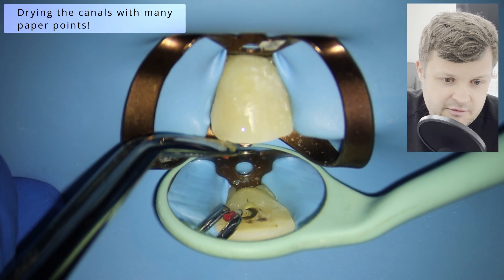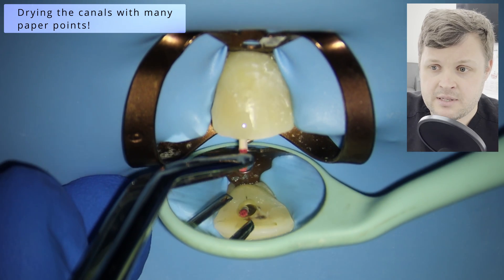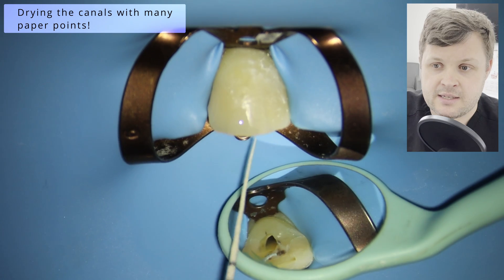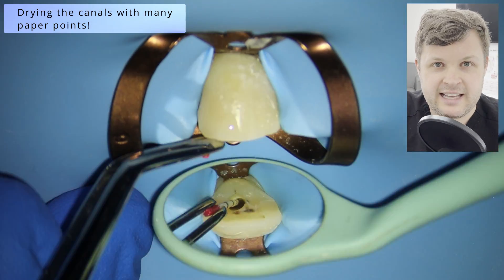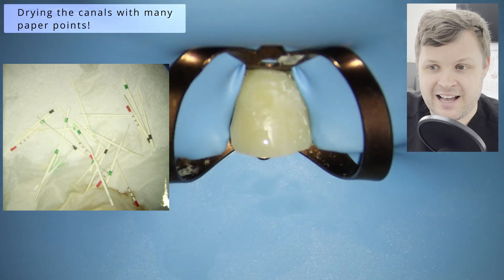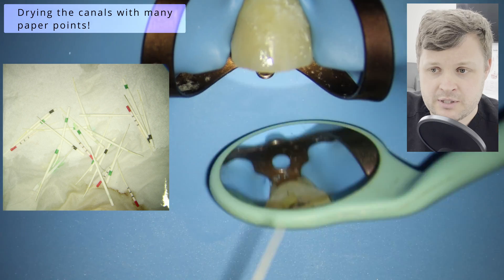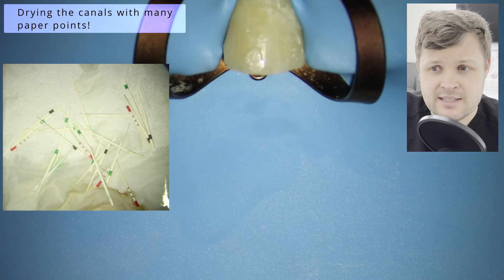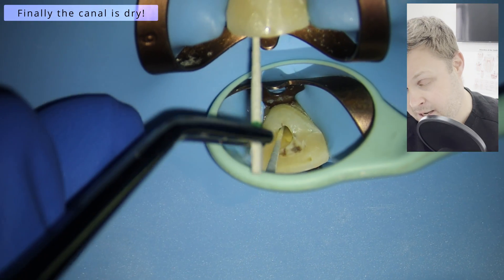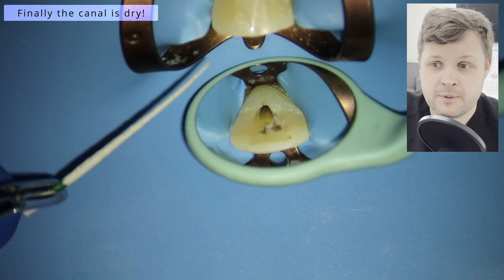Now we're going to attempt to dry the canal. I didn't really think I'd have a problem drying this tooth, but I was using size 25 diameter paper points and as I pulled them out they were sopping wet. The color of the paper points was kind of yellow — like pus or exudate. You can see in the picture how many paper points I actually used to dry this canal. I was getting halfway through and thinking, am I going to have to dress it with calcium hydroxide and bring the patient back? Luckily we managed to get a dry canal.